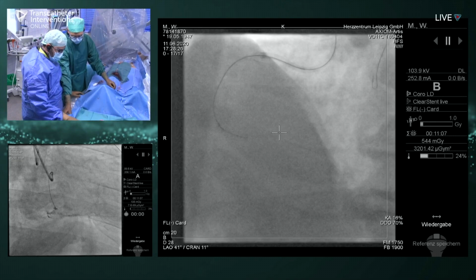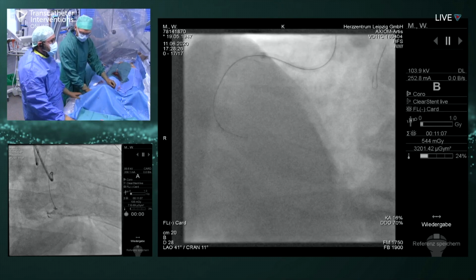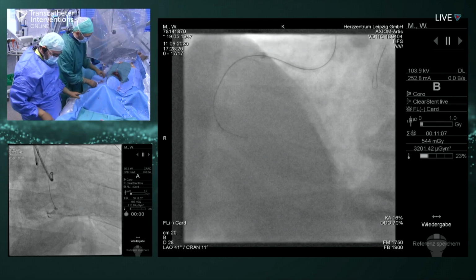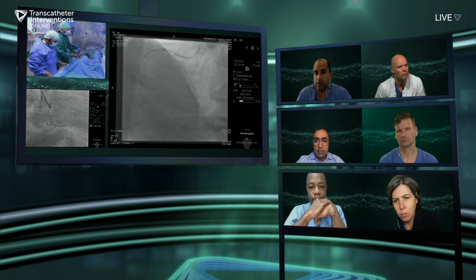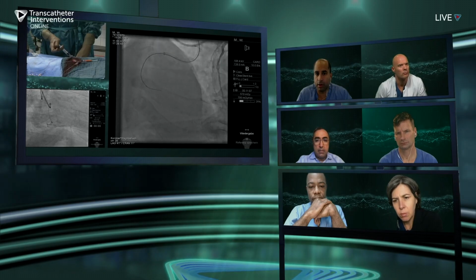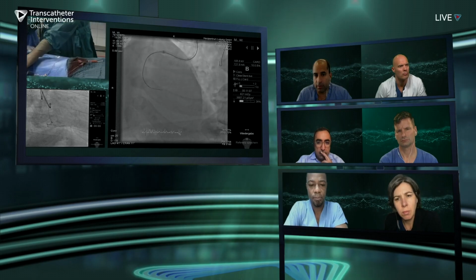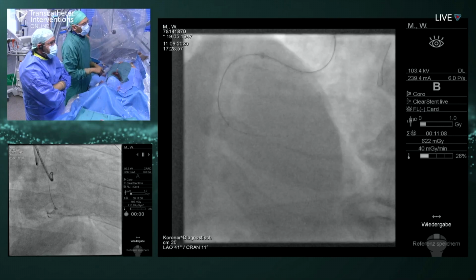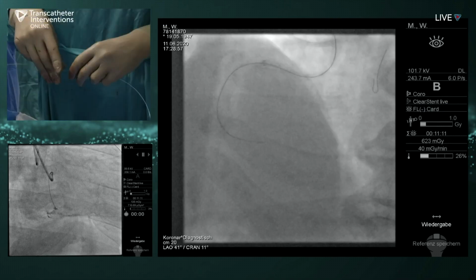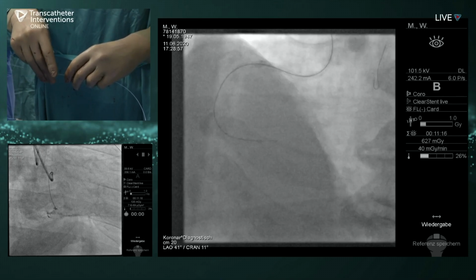This is the case where you could try the other microcatheter that's a little bit stiffer. They've shifted views, and they'll hopefully do a retrograde here and see what happens. The challenge with the Gaia, though, is if it's kind of free here, it was more dangerous than perhaps a jacketed wire with a knuckle. But because of the bifurcation location, you have to be cautious about knuckling too far down. It seems to be a very long segment. It's very long. Yeah, it's a very long occlusion.